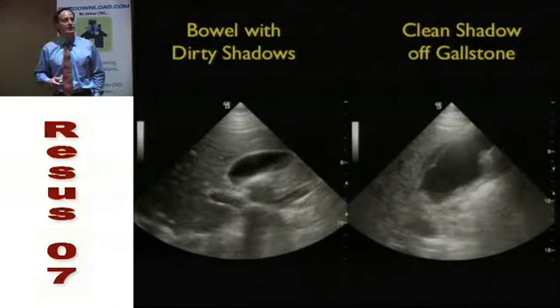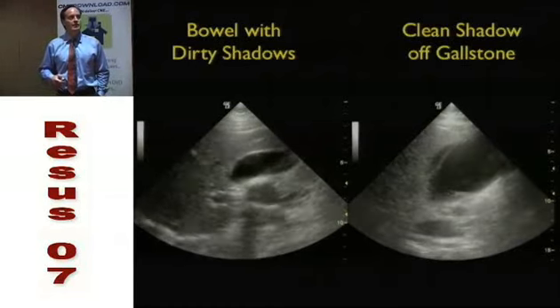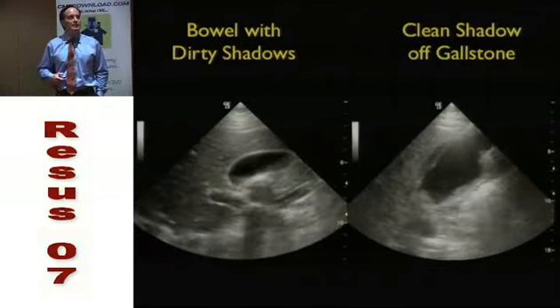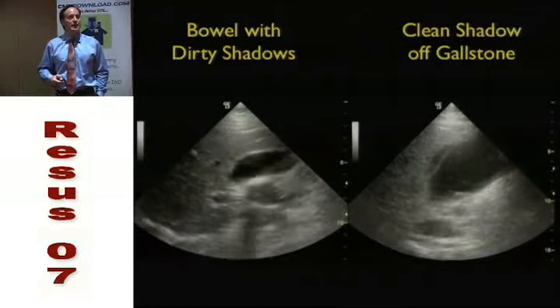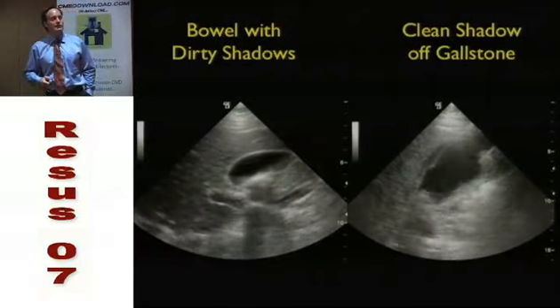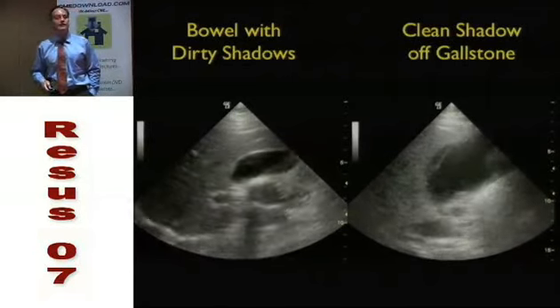Okay, you guys see that right there? Whereas look here, this is definitely a white shadow definitely within the gallbladder. This is not clearly within the gallbladder. And notice these hard shadows, the clean shadows right off the back. Whereas these are, we say, kind of dirty shadows off of gas. But I'm going to leave that more for the workshop.